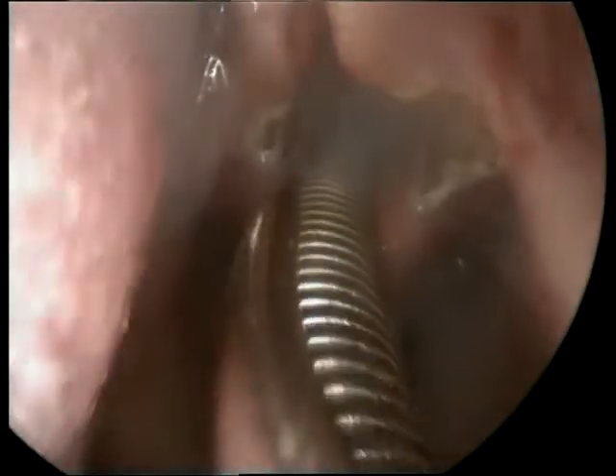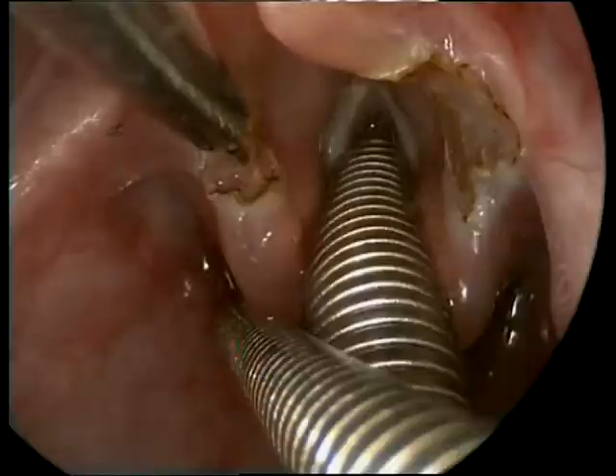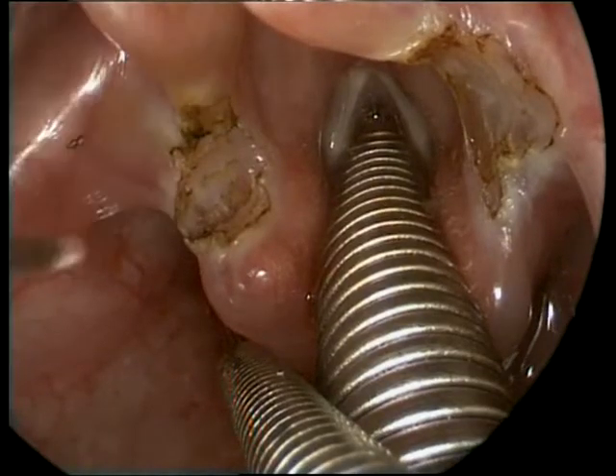As you can see, the suspension position achieved is less than optimal as the tube is pushing the larynx towards the left, and the aryepiglottic fold on the left side is not fully pulled like on the other side. The reason for that is that the metallic endotracheal tube is difficult to work around. So to avoid injuring other parts of the larynx or the hypopharynx, using a suction tip, I am pulling the tube medially while working on the aryepiglottic fold on this side.